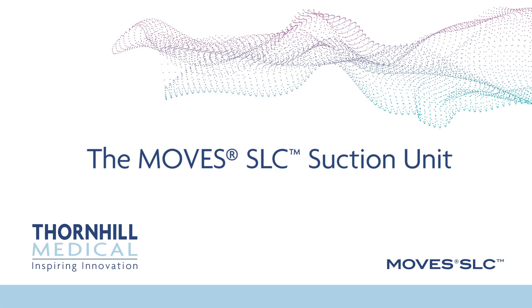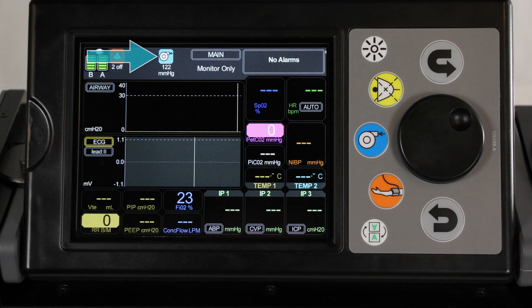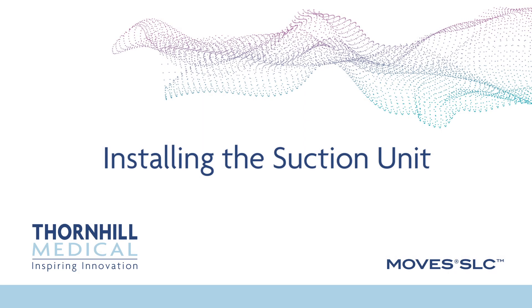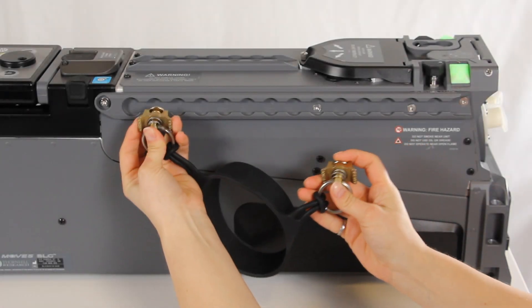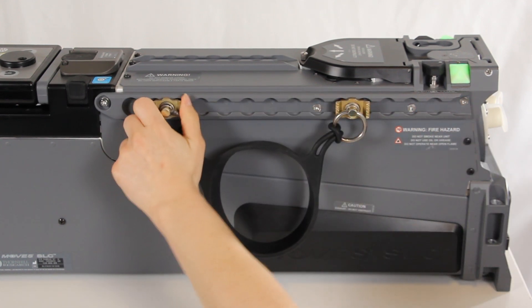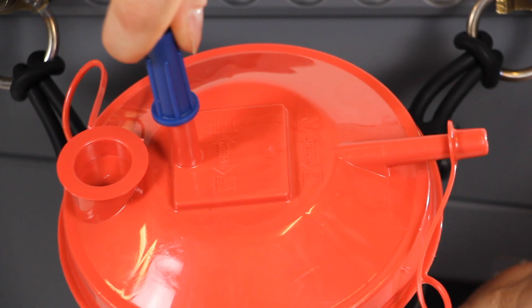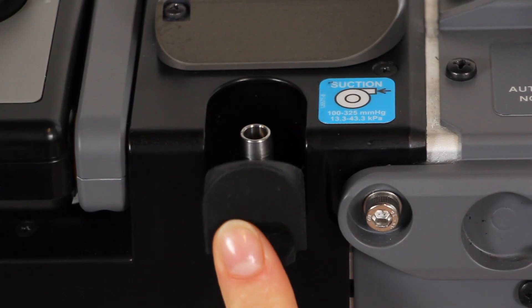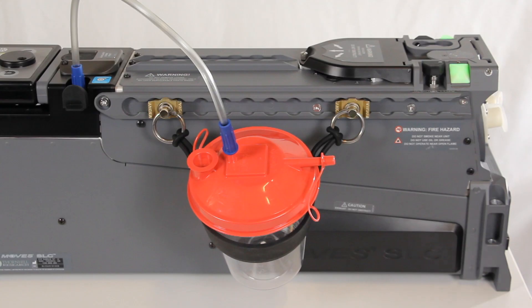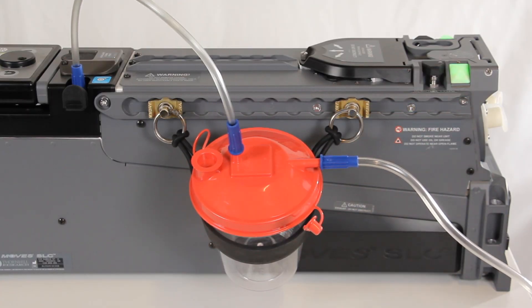The MOVES SLC suction unit. If suction is turned on, the suction icon will be displayed at the top of the screen. The NIBP icon is also shown at the top of the screen if NIBP is obtaining a reading. Installing the suction unit: attach the suction bucket holder to the MOVES SLC unit by depressing the clips and sliding them along the side rail into the preferred position. Release the clips and ensure that they lock into place between any two holes in the row. Insert the suction canister into the holder. Connect the suction hose to the suction inlet port of the suction canister. Open the protective cover of the suction port on the left side of the MOVES SLC unit and connect the other end of the suction hose to the suction port. Connect the patient suction hose to the patient port on the suction canister. Connect the patient suction wand to the other end of the patient hose.